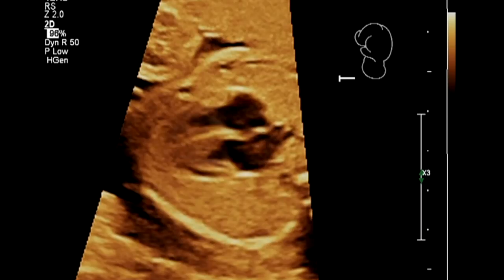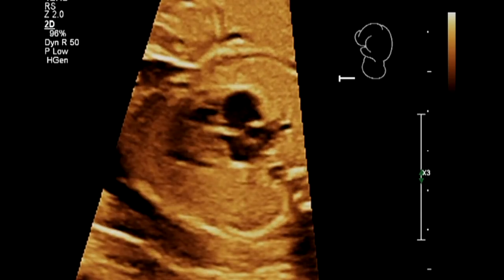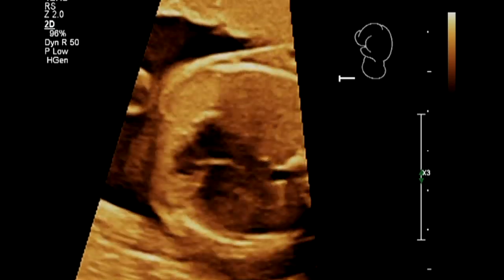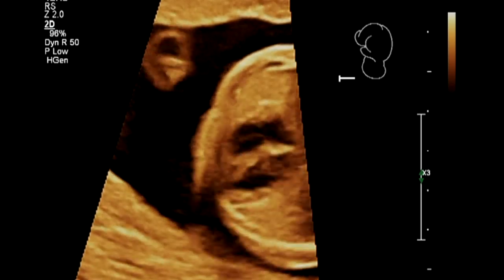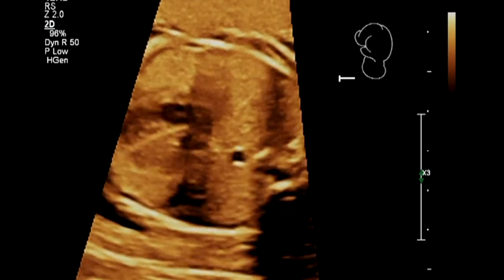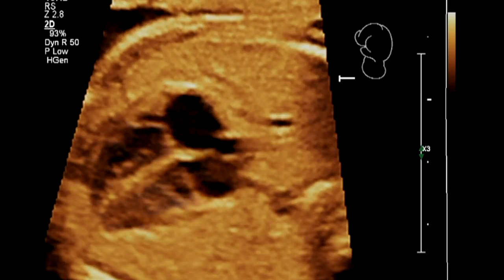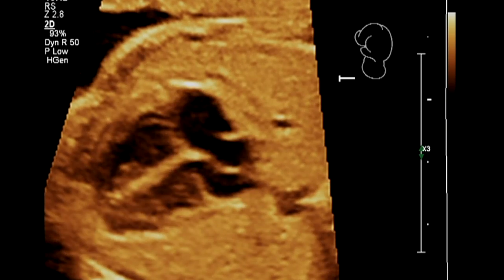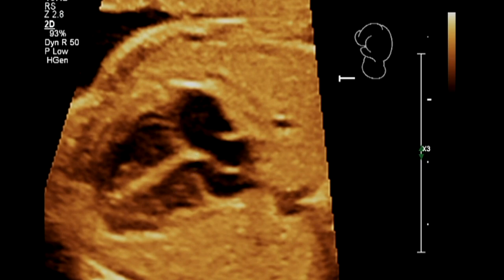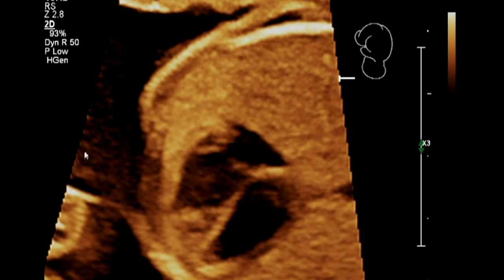That's where two hands helps — I have someone helping me so I can use two hands to push a little harder. I'm looking structure by structure. Right now I'm seeing a very important structure — the lower part of the atrial septum — and showing that it's intact. The baby is moving so it may not be as easy to see. I'm finding a different place on the maternal abdomen, and you can see the lower part of the atrial septum. I'll walk back — sometimes I start here. This is the lower part of the atrial septum, always important to see relatively perpendicular.